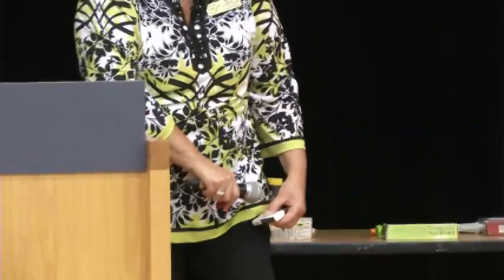Injection complete. This trainer may be reused for training purposes. The real one goes on to say this medication has now been used. See your medical provider for a refill. It's going to the emergency room with the kid. Parent will get the information then.